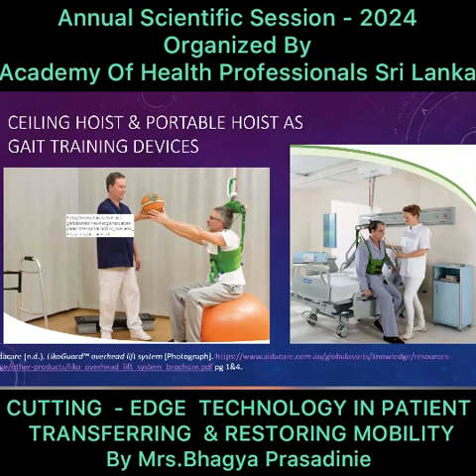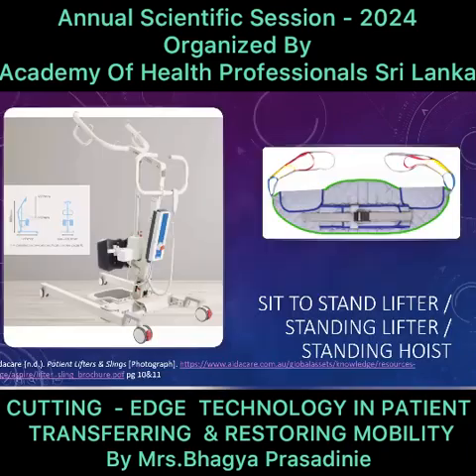So here you can see the ceiling hoist can be used for balance training as well as gait training. So next we move on to the standing hoist. Now, the ceiling hoist and the portable hoist we usually use for the people who cannot move by themselves.